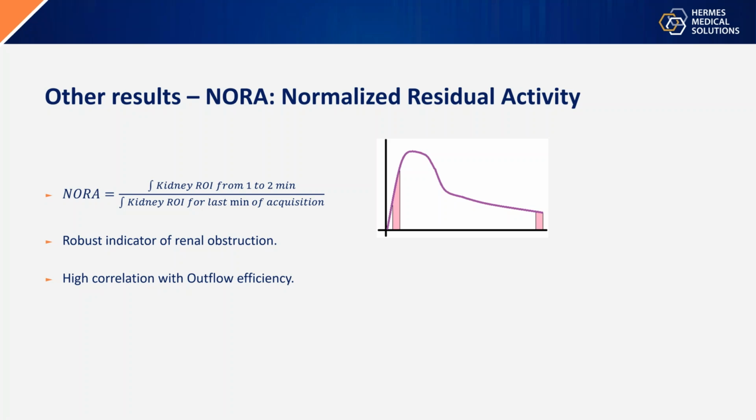And other than that, I haven't really seen much more out there on how to quantify transplant perfusion. I guess all of it suffers from the same problem: you've got a noisy image and it can be very tricky to pick out the iliac artery. But I'd be interested to see where that goes, if there is anything more out there. It's a question that people ask often, how to make an assessment of that. For now, I think we just recommend visual assessment based on the perfusion portion of the uptake.